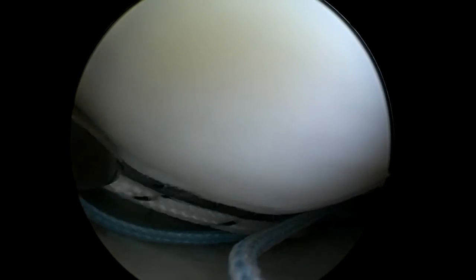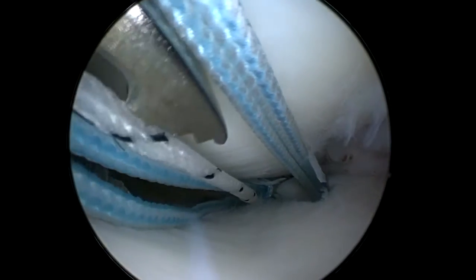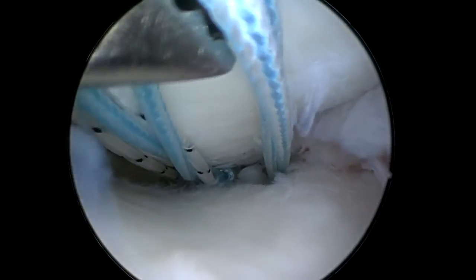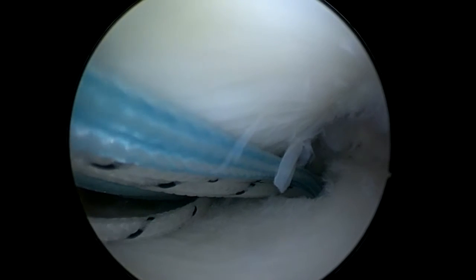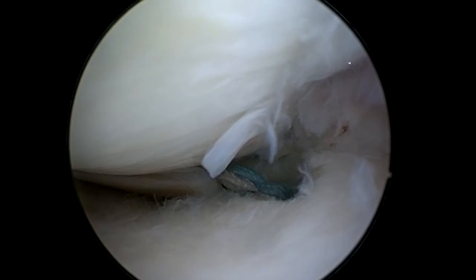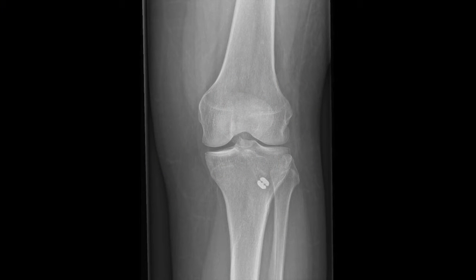The problem now can be a tissue bridge over all the sutures. So I take a grasper and in the grasper I take all the sutures, as you can see here, and bring them out through one portal. There is no suture left alone, and now through the loop, through the tibia tunnel, I put both ends of the sutures through the meniscus into the tibia tunnel and I will fix it over the tibia, as you can see here, with a button.